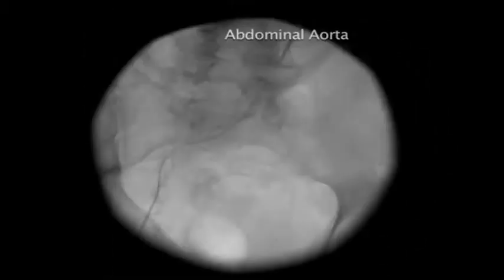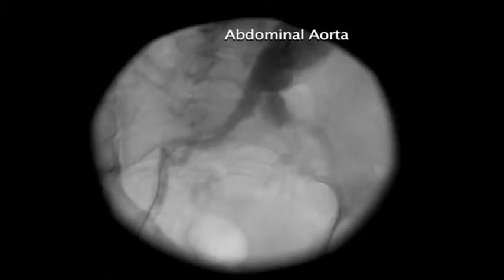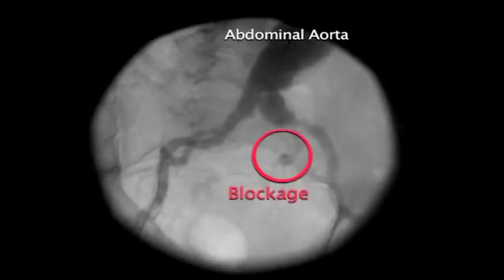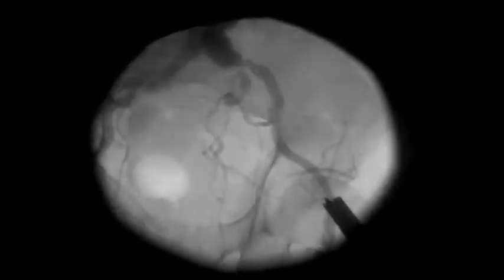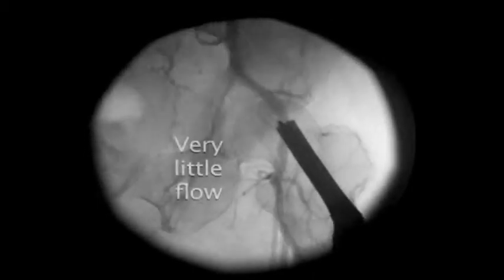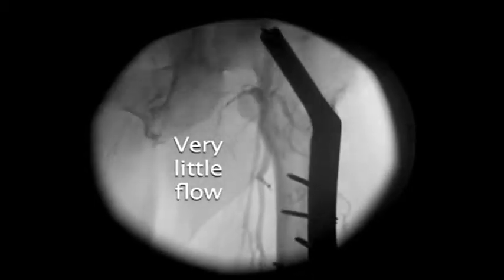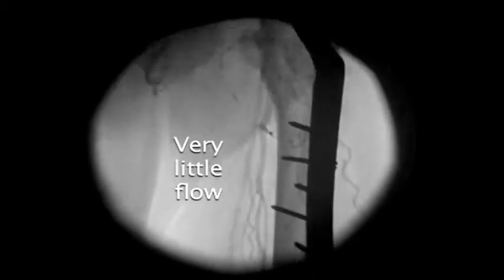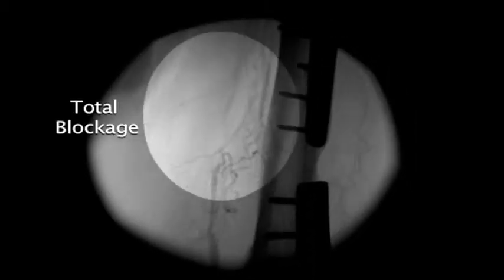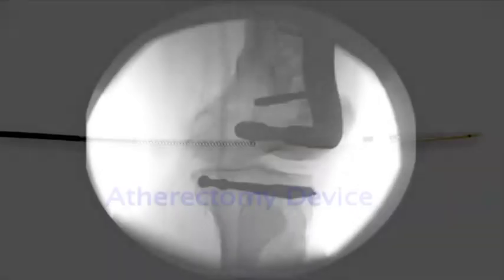This first picture is the abdominal aorta. You can see at the top the red circle indicates where the blockage is, and there you can see a hip replacement, very little flow, and a total blockage over a long segment, reconstituted above the knee.